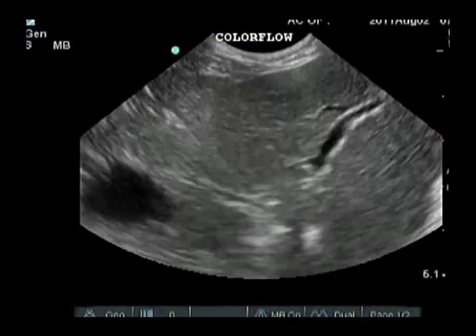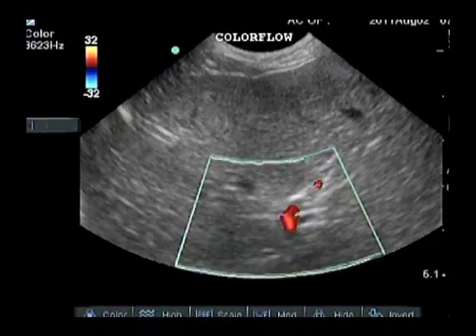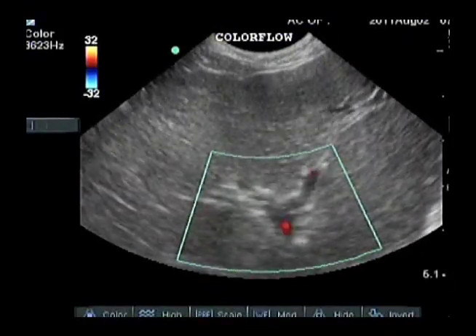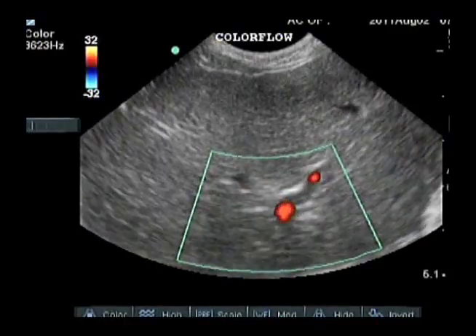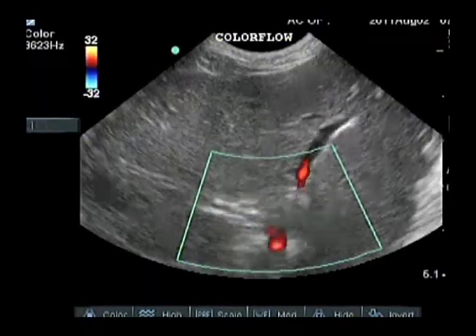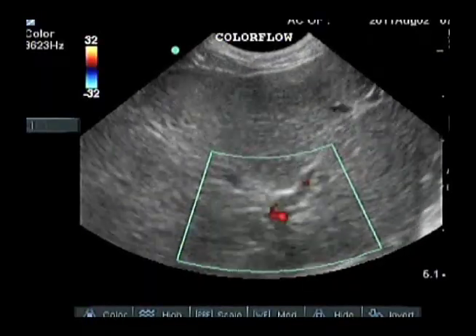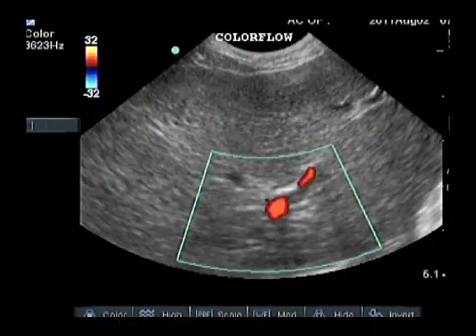In many smaller ultrasound machines, activation of Colorflow Doppler diverts computer capacity to the color flow function, and the frame rate of the live image decreases. You may notice that it takes a few frames for color to register, especially if the patient moves.